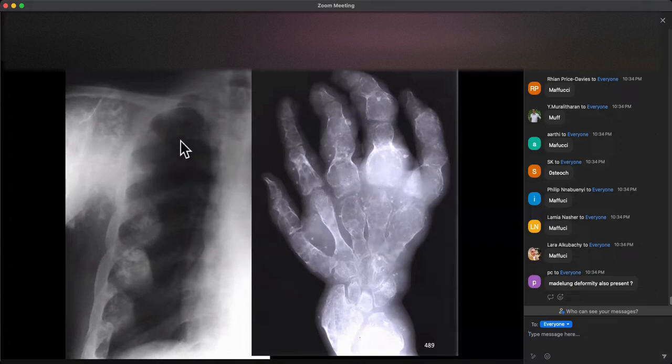This is the same patient, by the way, and there's no hint of any phleboliths on this particular film, but you can see that the enchondromas are existing around the costochondral junctions. Okay, so it's quite a rare condition, but when you see it, you instantly know what it is, because there's nothing else that looks like this. Okay, so it's Maffucci syndrome, and the pre-malignant aspect of this condition is obviously very important to pick up, and these patients get monitored.